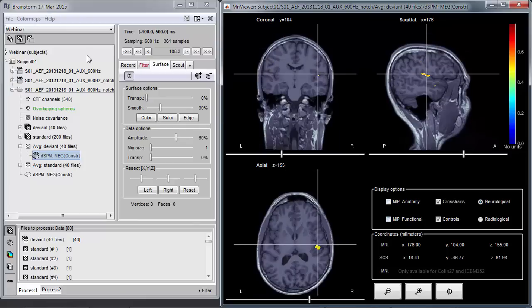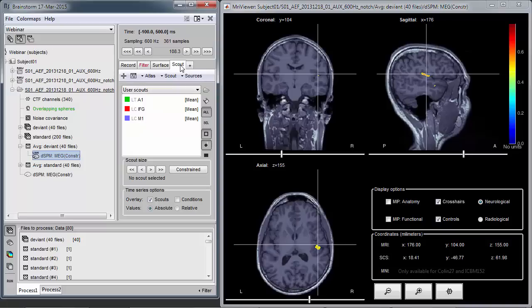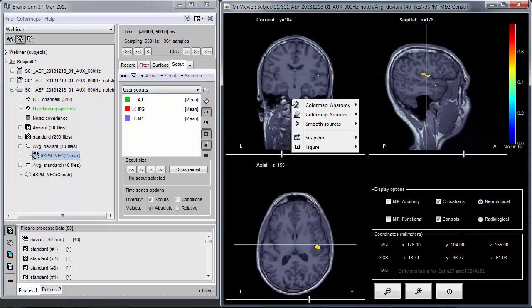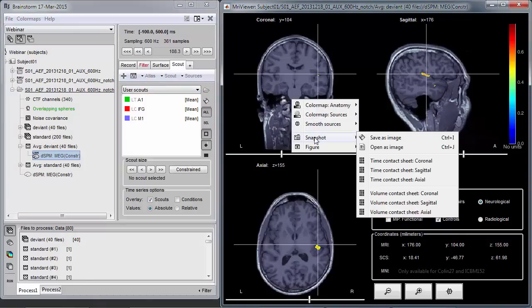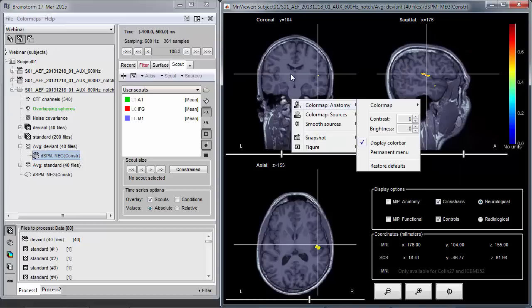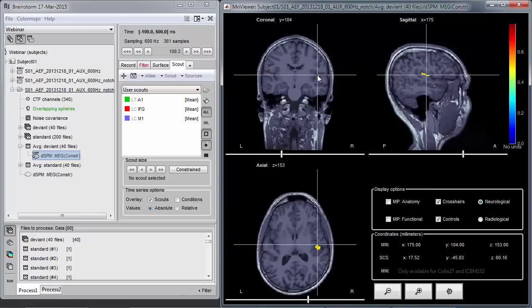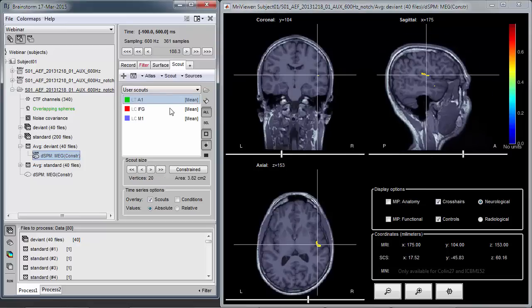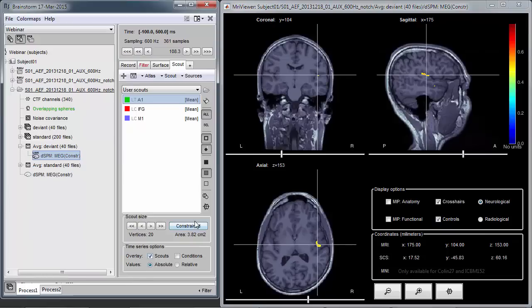To better appreciate what's happening in the volume, we can use maximum intensity projection and adopt a glass brain view, as is typical in brain imaging. You see that the functional blobs are now fixed, which is very efficient for producing illustrations for articles, papers, or presentations. We can generate snapshots directly in Brainstorm — right-click, snapshot, and I can save what I see as an image, or save the entire volume using different views.